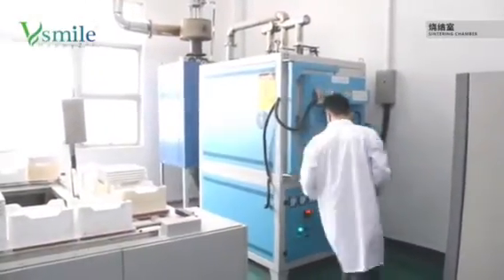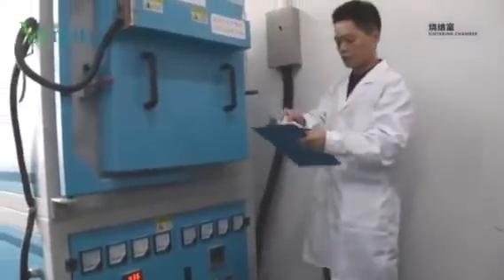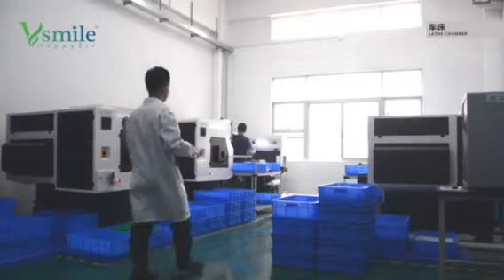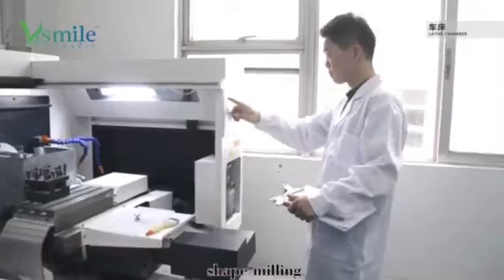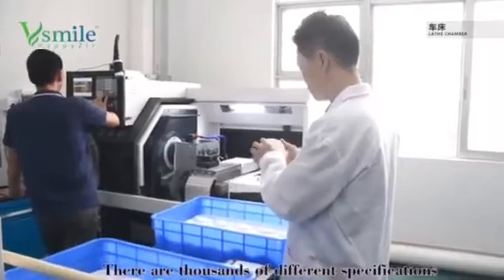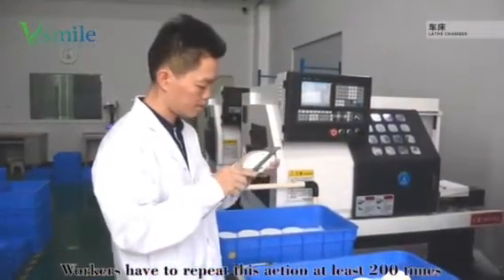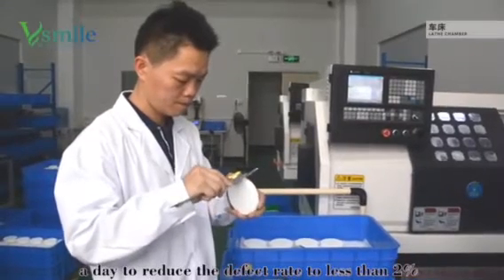Our QC manager carefully inspects every product, every production process, and every piece of equipment to ensure good and stable quality. The fourth process is shape milling. We must ensure the surface finish and accuracy of the block thickness. There are thousands of different specifications, so I confirm each process flow sheet several times. Workers repeat these actions at least 200 times a day to reduce the defect rate to less than two percent.